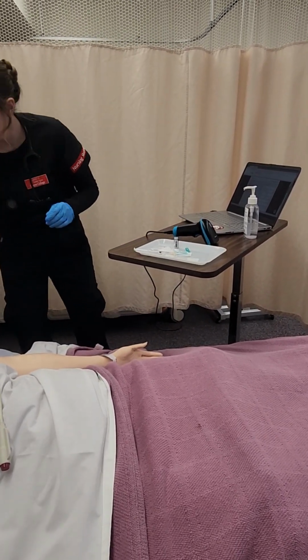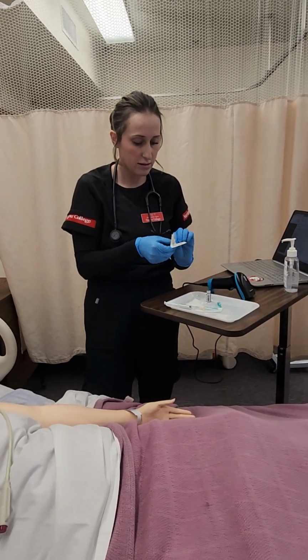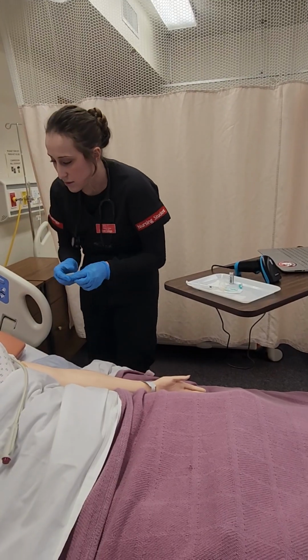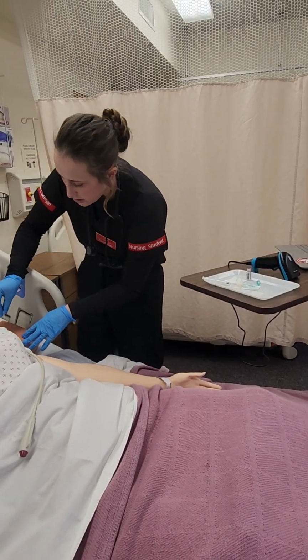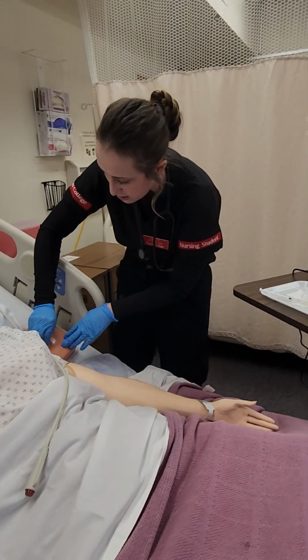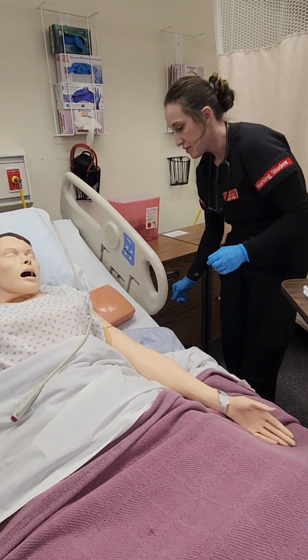All right, I'm going to be giving this to you in the back of your arm if that's all right. Yes. Okay. So I'm going to look for any injuries or previous injections and clean the area. Going to let that dry.